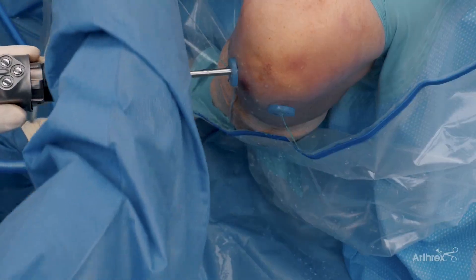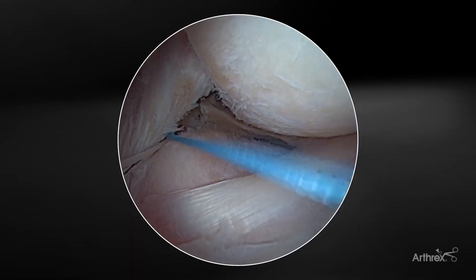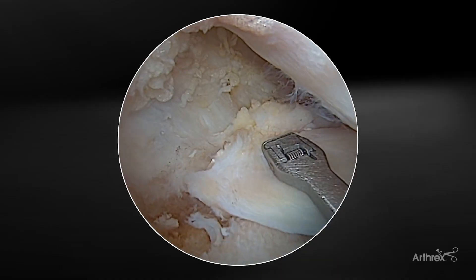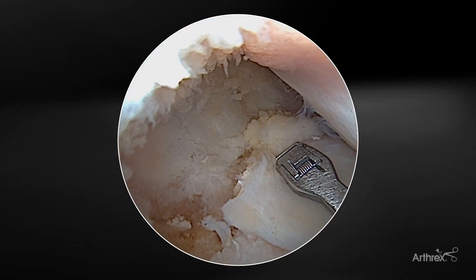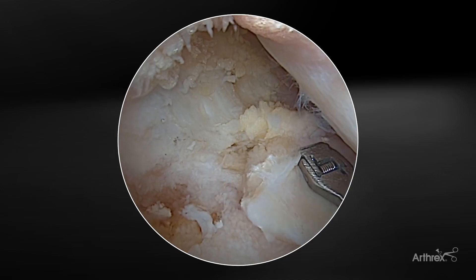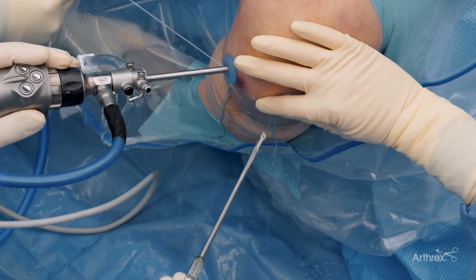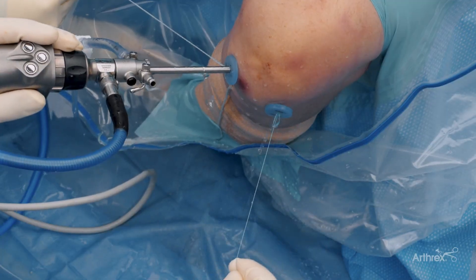The first suture is going to be a vertical configuration. I always like looking at where the needle is going to come out and making sure that that first pass is really robust on the vertical suture configuration. We want to make sure we're not too far over because that will not leave enough robust tissue. We want to have enough tissue that holds the suture in nicely. I gently tilt the meniscus scorpion so that you can see the needle and look at where it comes out. One pearl is to just slowly squeeze the needle and watch the needle and suture come through the jaws.